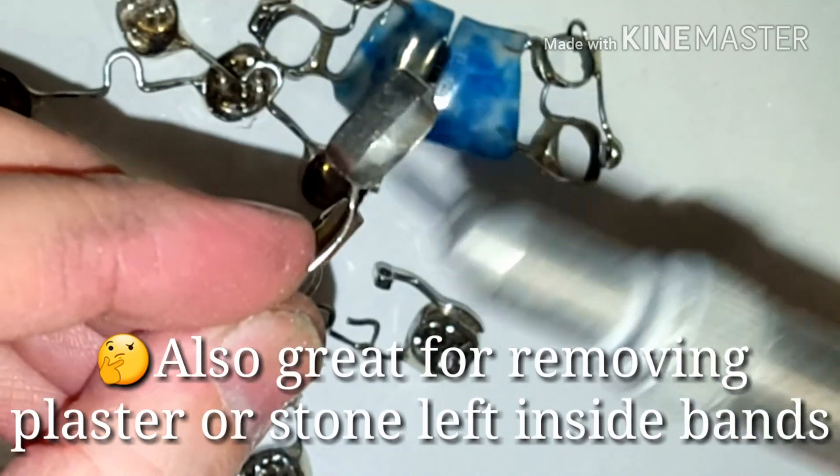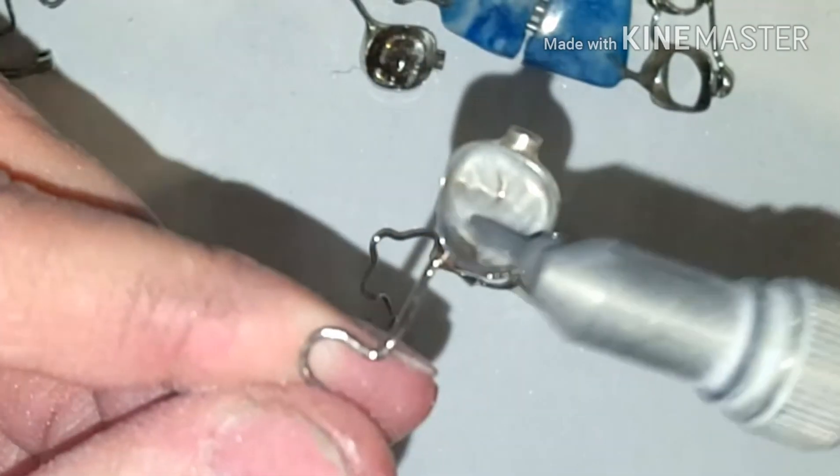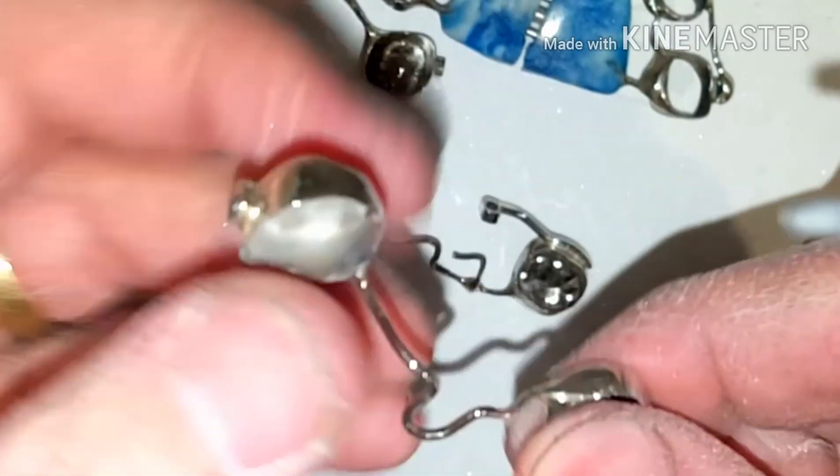By reshaping the surface, micro-etching is pretty much like sandblasting. It allows a better bond.